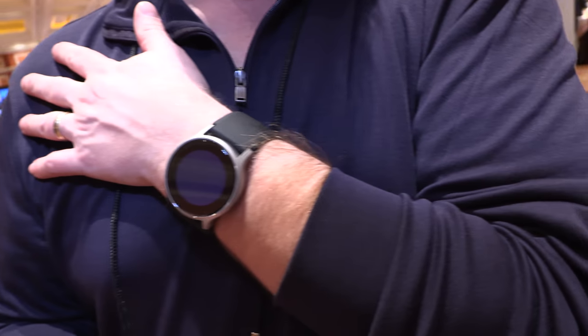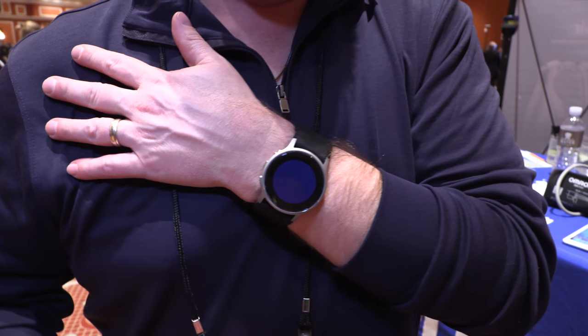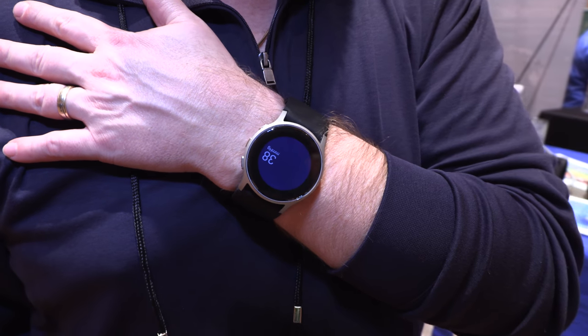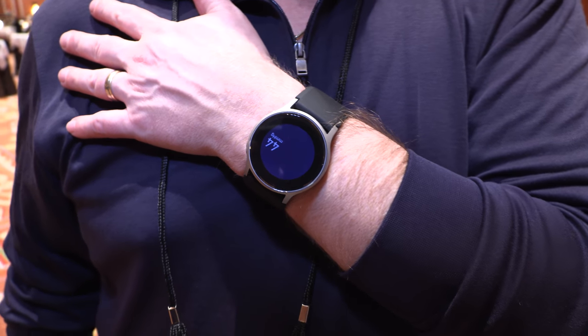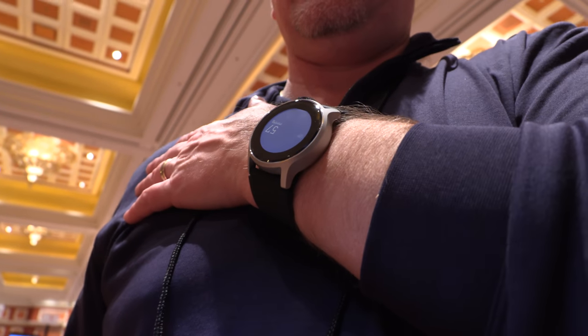I would have to put my hand over my heart. Any time you take your blood pressure at the wrist, you have to put it at your heart level. That's interesting. And so it is now starting to inflate.